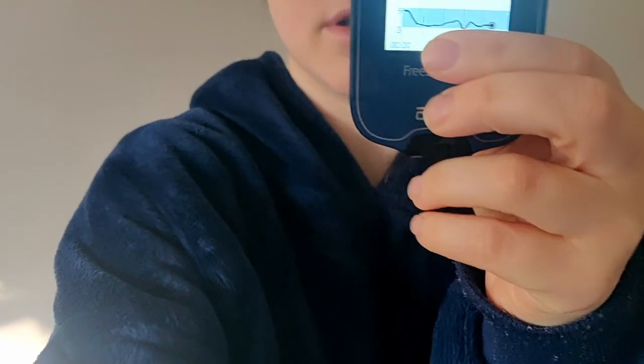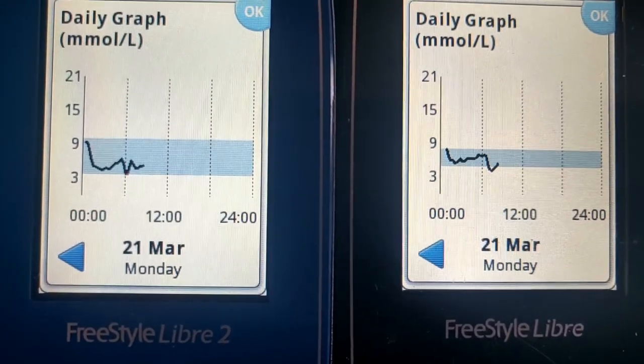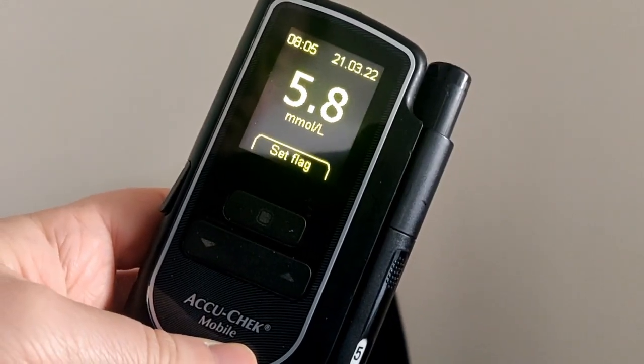Good morning — it's the next morning. Let's look at the overnight graphs on both sensors. Freestyle Libre 2 says 5.2; the Libre 1 says 4.4 and going down, and flags 'glucose going low'. The Libre 2 graph is a bit wider to look at, while it's a bit smaller on Libre 1, but they're roughly the same shape. Checking on my real monitor: 5.8. So the Freestyle Libre 2 is actually reading closest, and both are in the 4–5 range. They're kind of around the same.